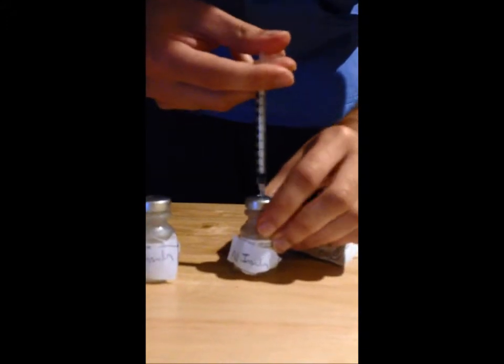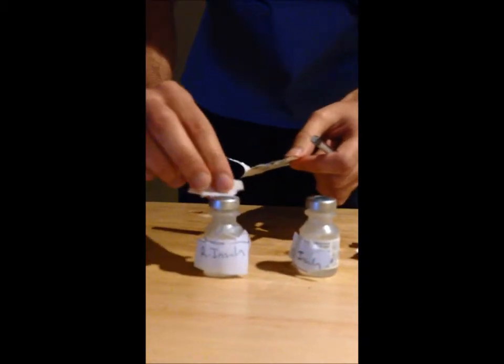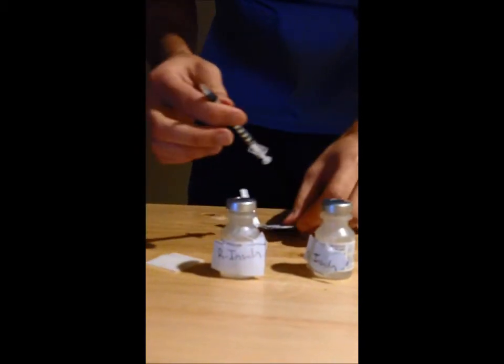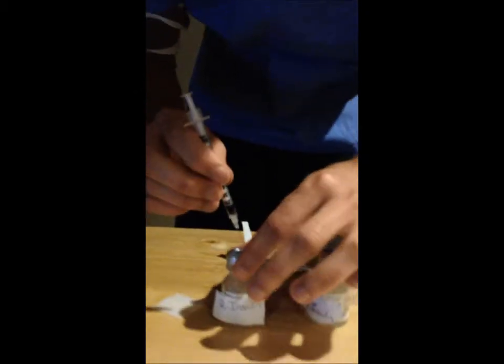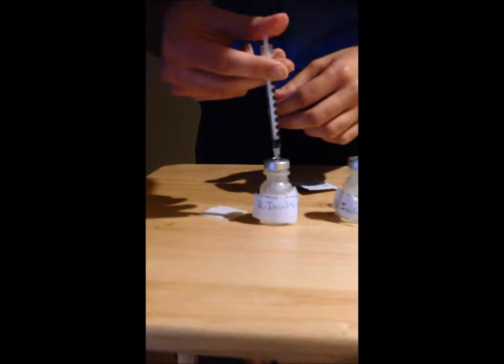So 16 units in, and then I'm going to swab this end, and 4 units are going into the regular insulin, going up in increments of 2, so 4 units would be right there. And I'm going to stab it, and there we go.